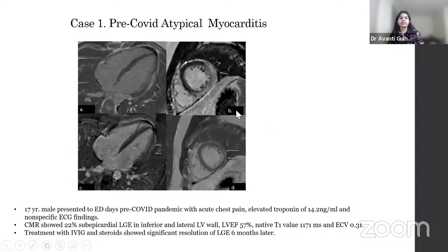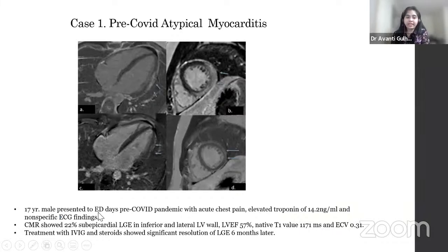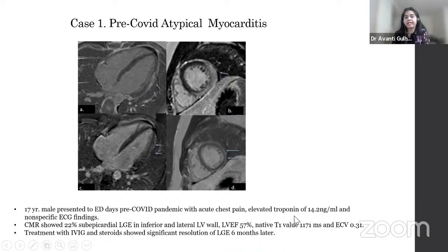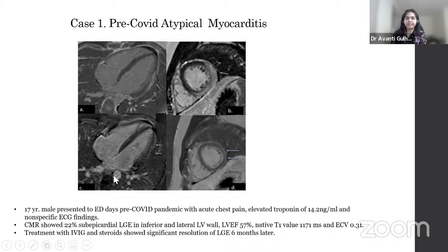A pre-COVID era atypical myocarditis case: a 17-year-old male presented to the emergency with acute chest pain, elevated troponins, and nonspecific ECG findings. Cardiac MR showed subepicardial enhancement in the lateral and inferior walls amounting to 22% fibrosis. LV ejection fraction was normal. Native T1 values were significantly elevated, and ECV was mildly elevated. The patient was treated with IV immunoglobulins and steroids, and significant resolution of LGE was seen six months later on follow-up.